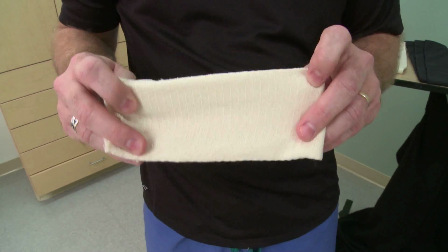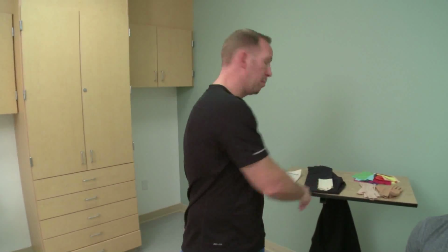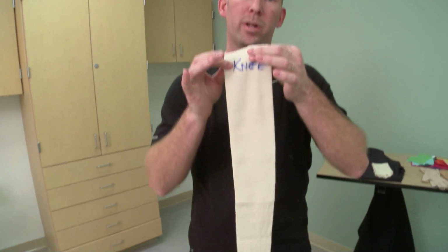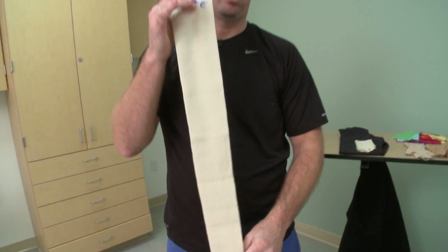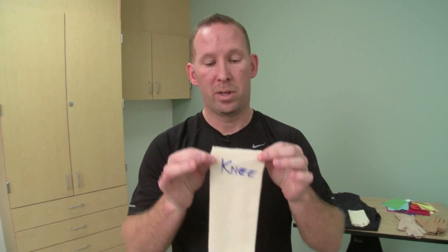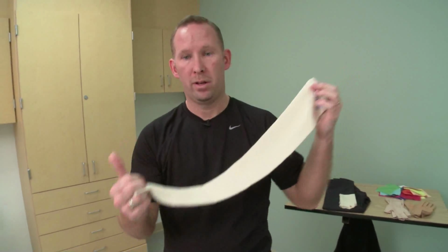I had mentioned tuba grip as a brand name of tubular compression that is often used. We also use another type of interim compression that is shaped. In this case, this compression is wider at the top and more narrow at the bottom. This often is used on upper extremities, arms, and legs, usually from the toes to the knees. As you can see, I've labeled this knee because it's wider at the top and more narrow for more compression at the foot region.